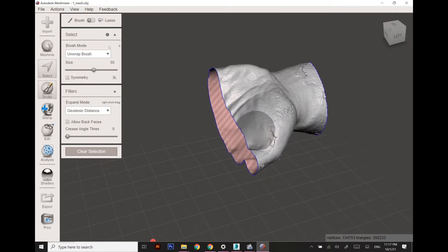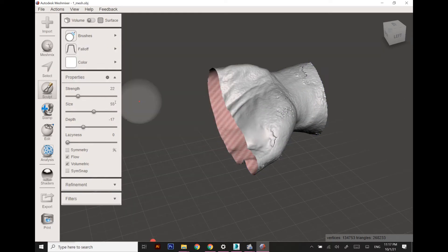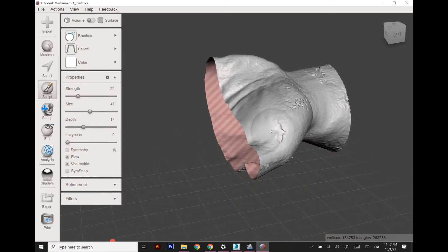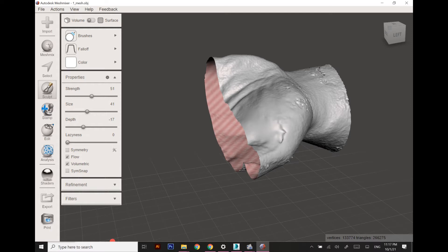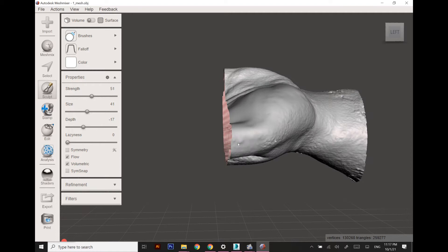It is quite rough right now, so before designing anything I need to make the scan data with regular polygons. I'm going to smooth it out by using the Shrink Smooth brush.